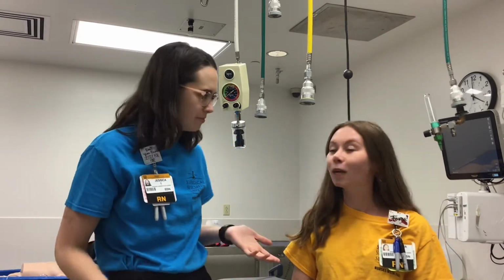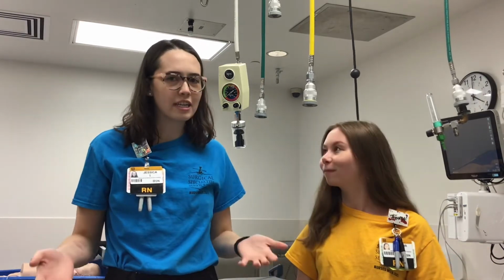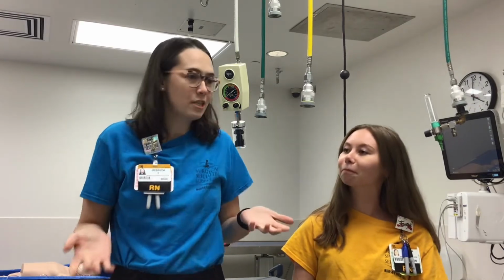My name is Jess. I work in the surgical ICU. My name is Delsha. I also work in a surgical ICU. And we're going to tell you, our captive audience, all about the Wound Scout. Very simply put, it's a fancy tool that we can use to detect pressure injuries and DTIs on our patients. Delsha, when do we use the Wound Scout?